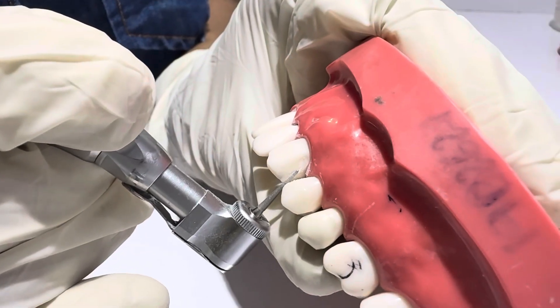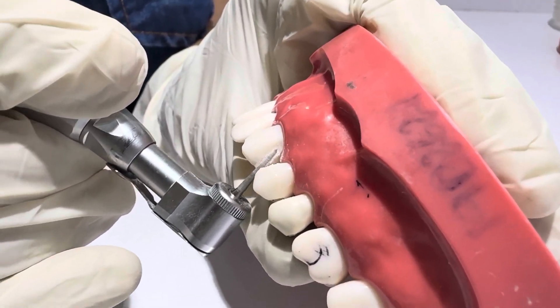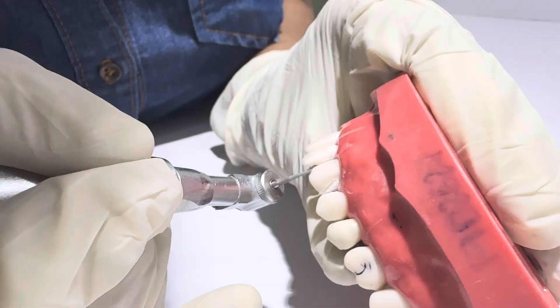Step 5: Proximal reduction. Use a thin tapered diamond to break proximal contacts carefully. Extend reduction toward labial and lingual, preserving the gingival margin. Ensure smooth, continuous walls.